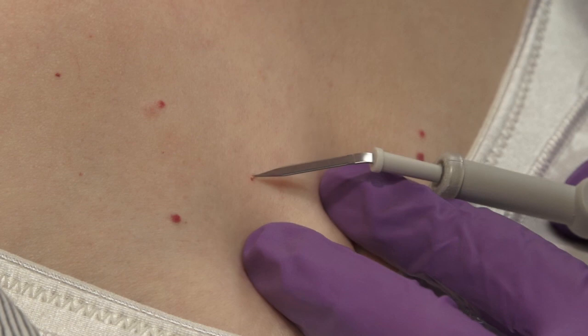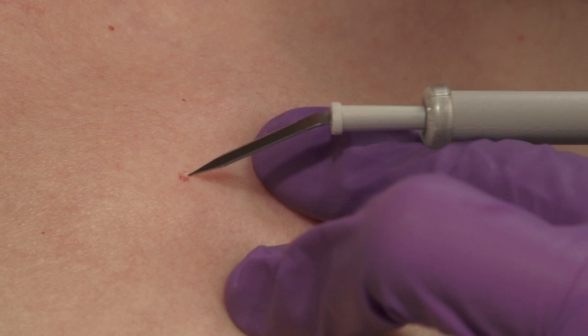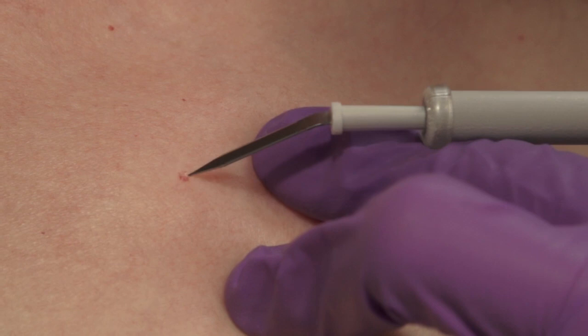A sharp-tipped disposable electrode is used to eradicate multiple small cherry angiomas on the chest. The power setting is 2.1 watts on low. Watch how the red color disappears as the cherry angioma is eradicated.